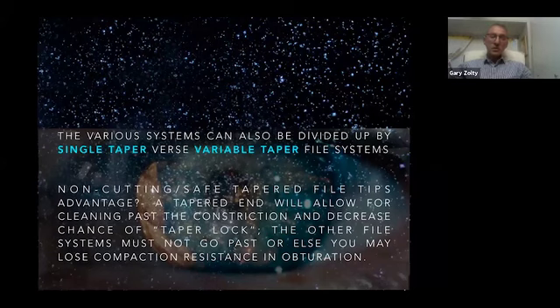What's the advantage of non-cutting safe tapered file tips? Tapered end will allow for cleaning past the constriction and decrease the chance of taper lock. Taper lock is when the full cutting edge of the whole file engages in the dentine. So that means that any further rotation requires a greater torque. And in that case, there's a greater chance that you might have a file fracture.